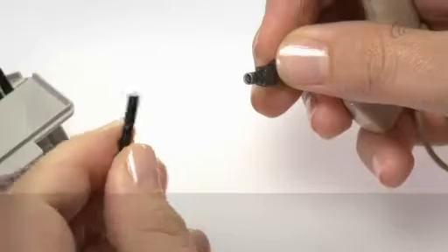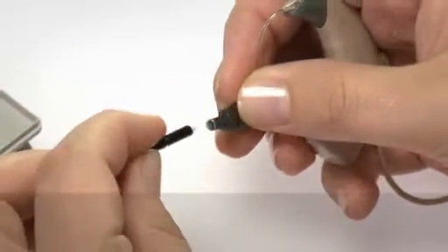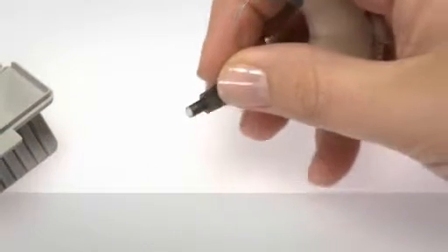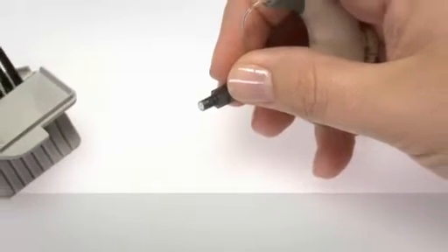Turn the tool around and insert the new filter into the sound outlet. Carefully pull the tool free and dispose of the used tool and filter.